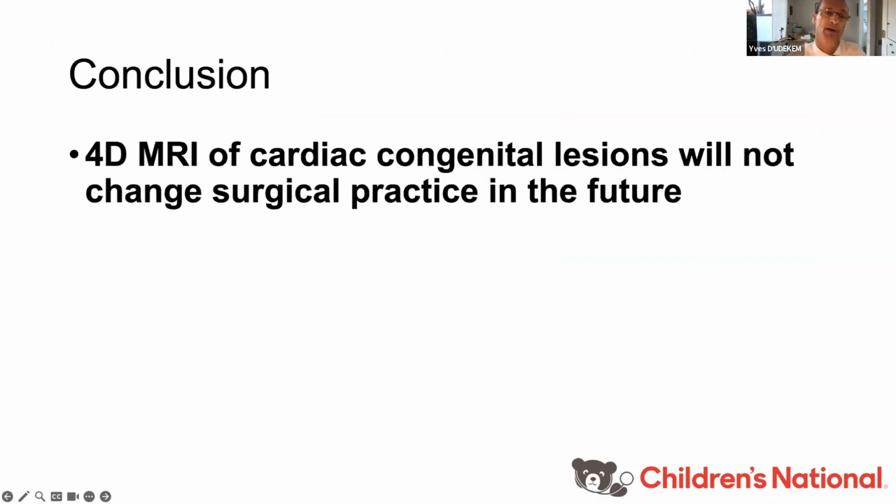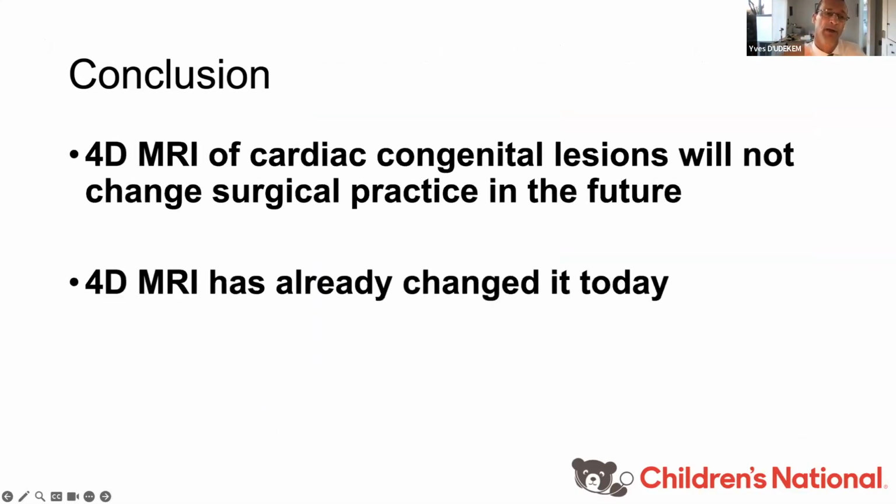So in conclusion, I think it's no longer a matter of knowing whether 4D MRI can help to change the future. I contend that 4D MRI has already changed practice today. Today, because of these studies, I have changed from the extracardiac conduit to the lateral tunnel.